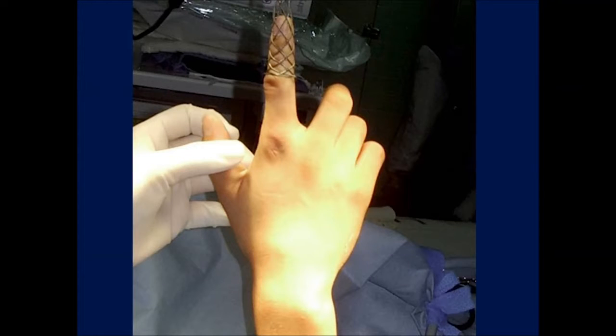The patient was placed in supine position under axillary brachial plexus block. In addition, we provided 5 kg of traction to the right index finger while placing it in a finger trap.